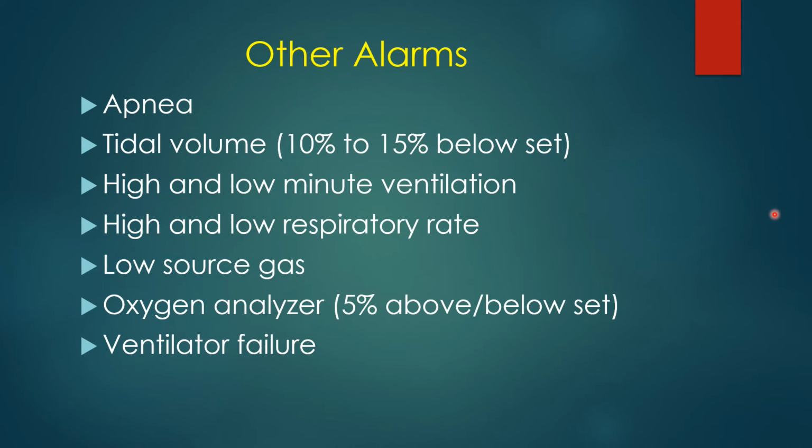And then, of course, if the ventilator just fails, you will get an alarm, ventilator failure. Now, all of our modern ventilators have an internal safety valve. So if the ventilator fails for whatever reason, a valve opens so the patient can breathe in and out. Now, he's going to be breathing a lot of CO2 perhaps, but he's not totally locked out from the ventilator. And these alarms need to be responded to pretty quickly because some of them can indicate a very serious problem that you need to fix right away, or at least be that Sherlock Holmes detective and get in there and figure out what is going on that's causing these alarms to go off.